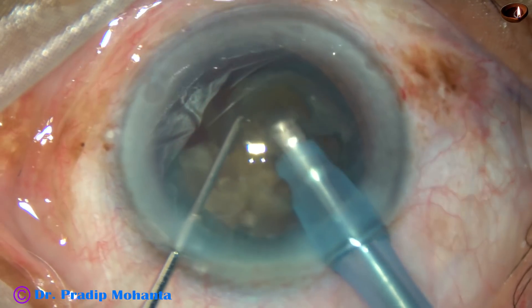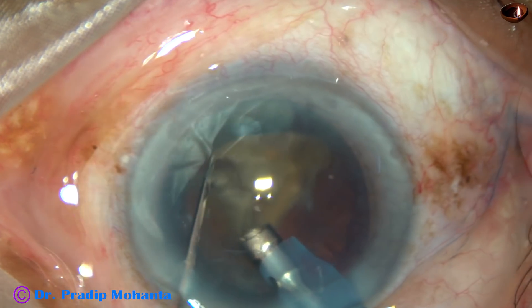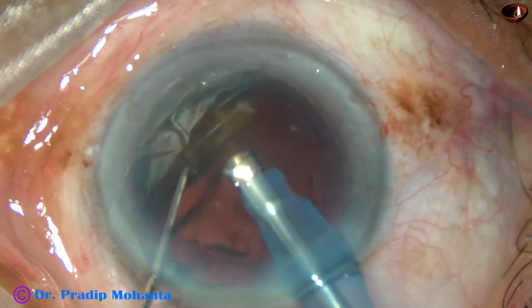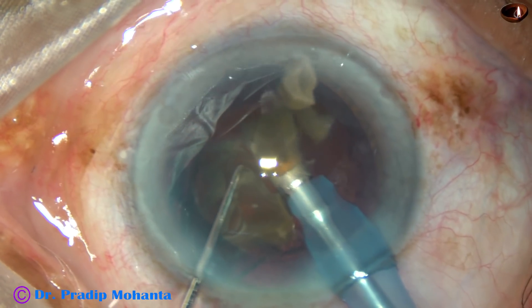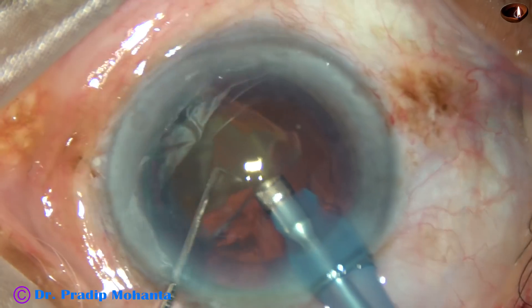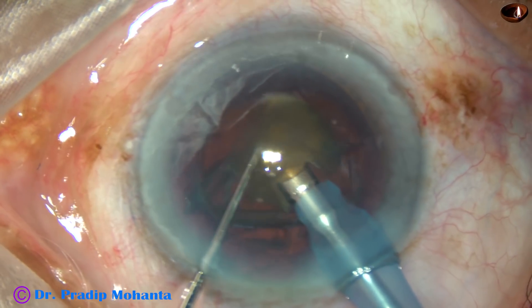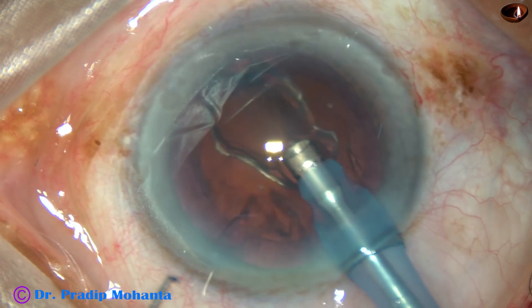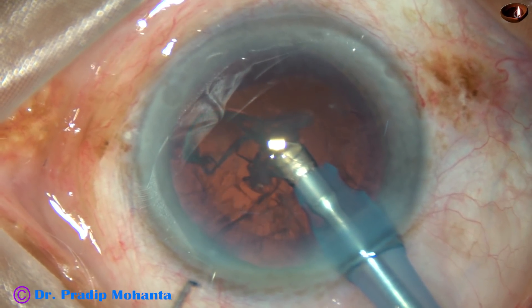I hope this incident has not yet occurred. At this moment, there is no posterior capsular rent. I tilt this, apply a little energy here, and thus I separate the two pieces completely. At this moment, probably, there is a posterior capsular rent. So maybe, when I tried to separate the two pieces of the hemi-nucleus and applied energy at the point where the two pieces were joining, the rent probably occurred at that time.